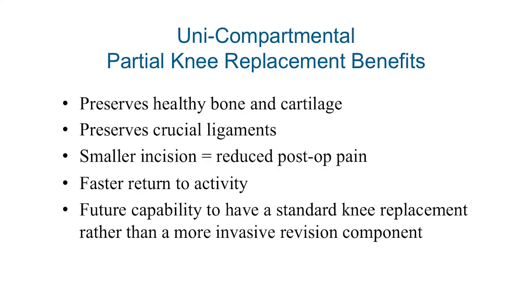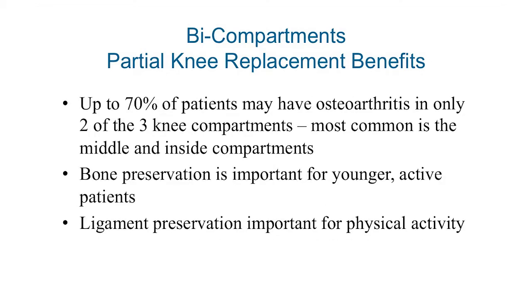The benefit of a partial knee replacement for those who are candidates is that it feels more like a normal knee, and the recovery is that bit quicker. So if somebody has arthritis in their patellofemoral joint and the medial compartment, there are a couple of companies that make these, duo or bicompartmental, and of the 3 types, the uni or partial, the total, this is the least common of all 3, but it is a potential option. And now we go on to the even more scary part, which is the total knee replacement.